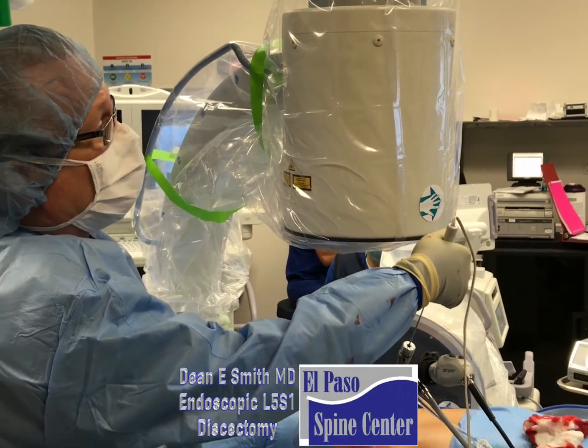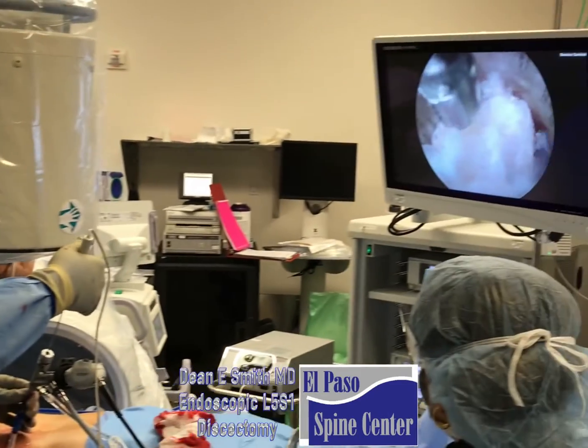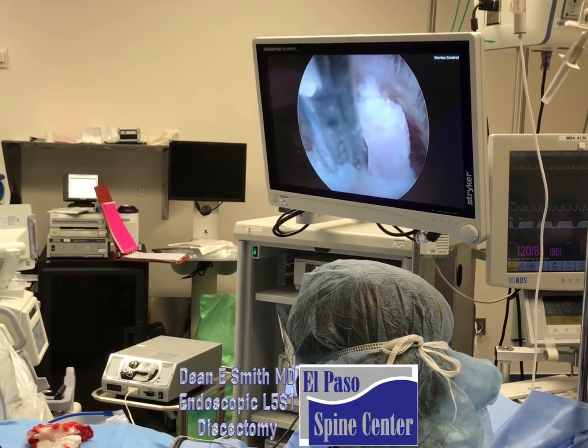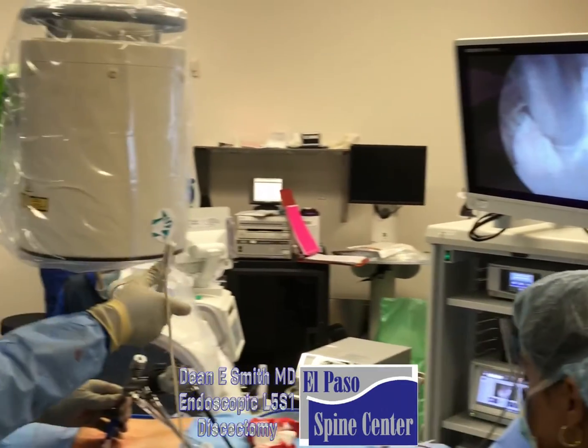You can see I can hit this thing and it will ablate it. We can take out some of the disk like that. It's the disk material that pinches on the nerves, and of course it then causes sciatica.